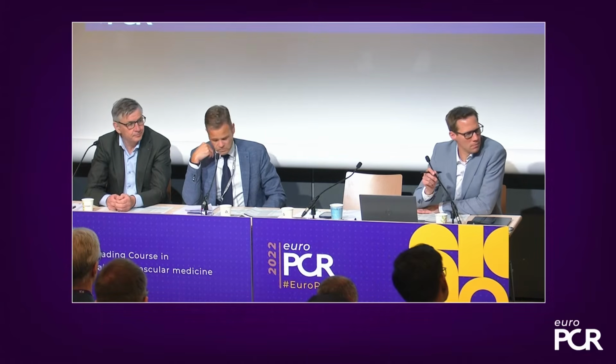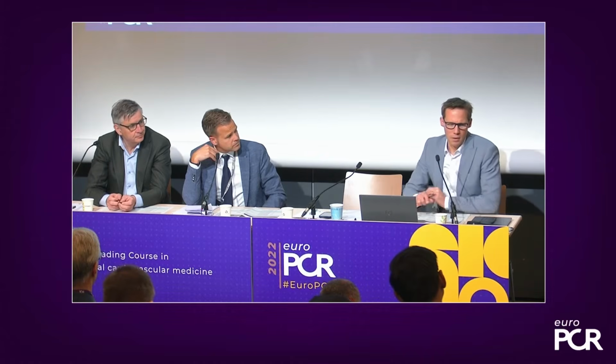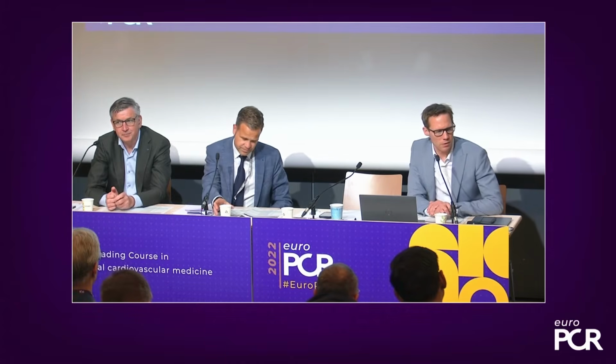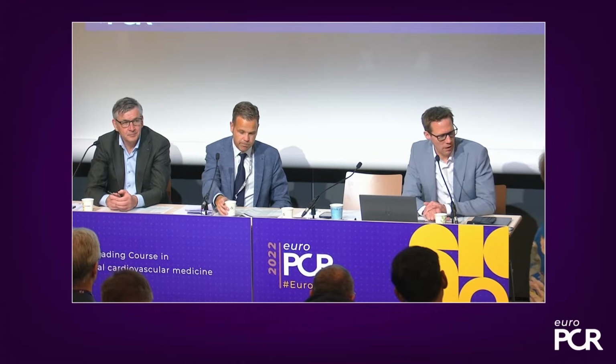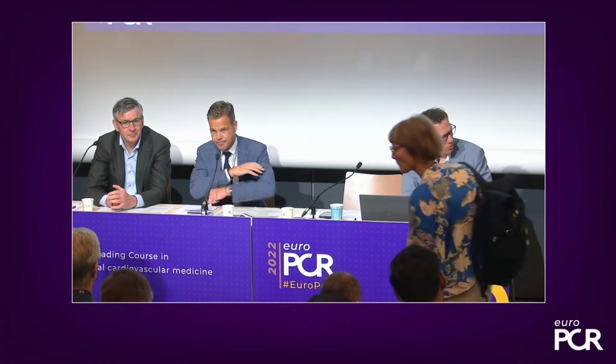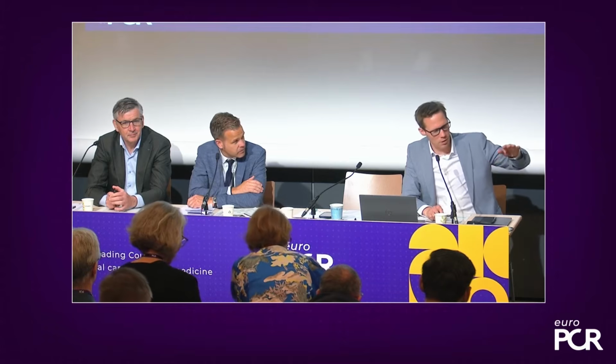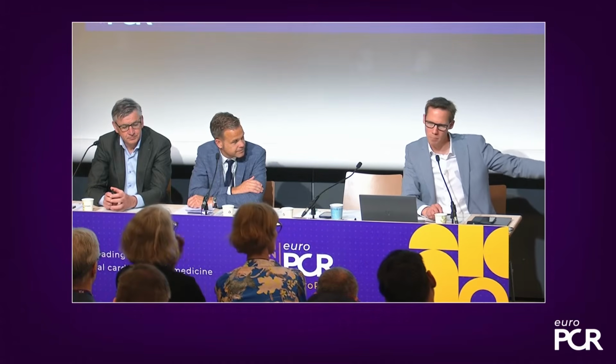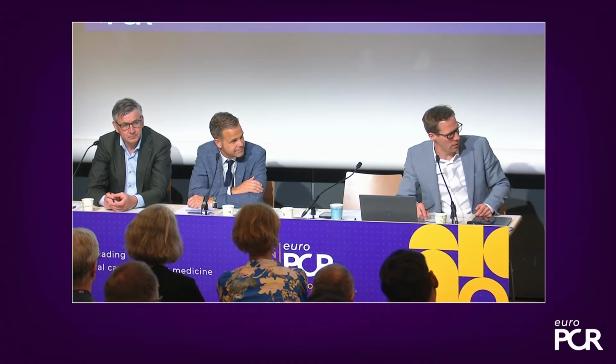Good. And Darren, you would take this patient directly to the table, or? Let me tell you a little bit about the situation in Ireland. We have reimbursement, that's not an issue, but we don't have easy access to general anesthesia. So what often happens is that you do a TOE because you want to assess whether the patient has thrombus, but then you can't actually treat the patient for 3 months, 4 months, 6 months. And by that point, the assessment of thrombus, you need to repeat the TOE.